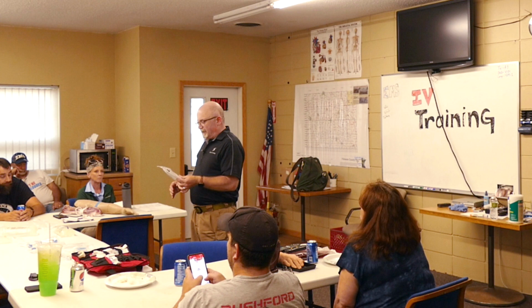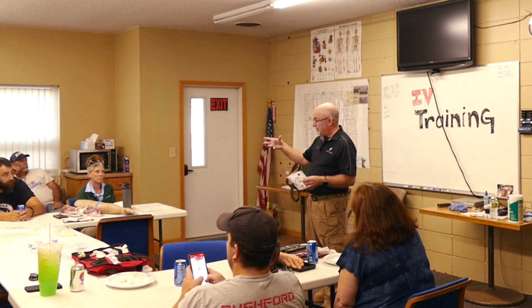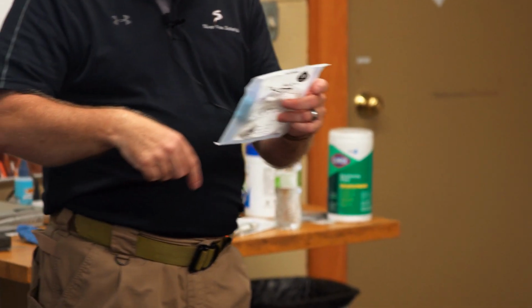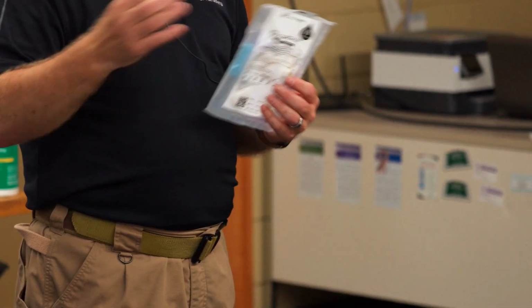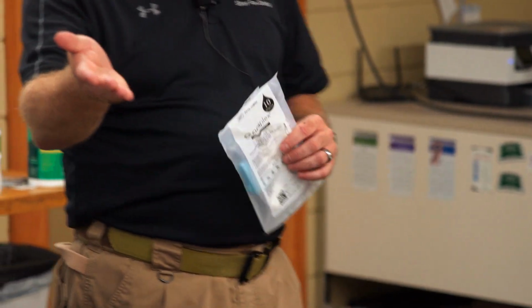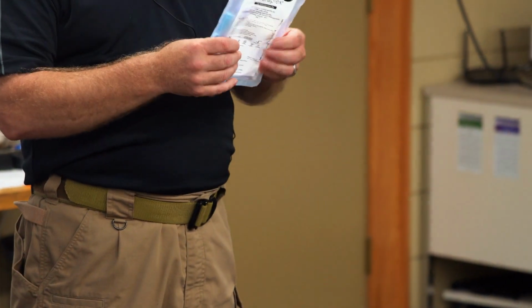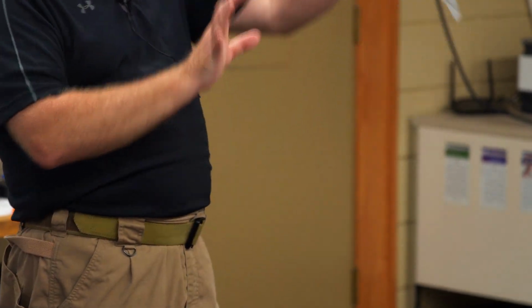Where if you really want to start playing a little bit is adding a Buretrol. So it's got about a 50 or 100 mil little chamber with another 60 set on the bottom for peds, so you don't fluid overload peds. If you really want to start having some fun with that, you can add that in, which also gives you a 60 drop set, especially if you go part-time ALS and you want to do an epi drip without a pump. Because, yeah, it's a lot of math, and I have to go get my calculator out when I do it. Anyway, so I'm going to tear into this.